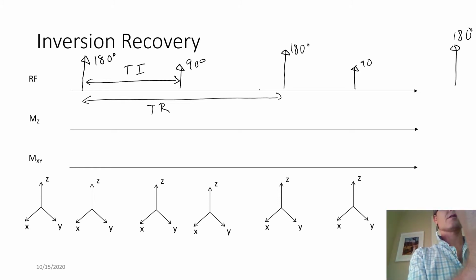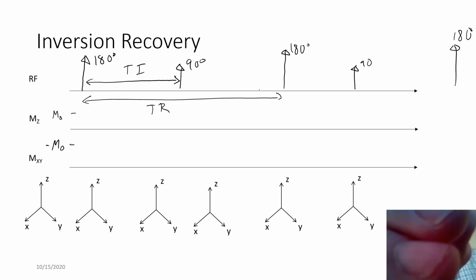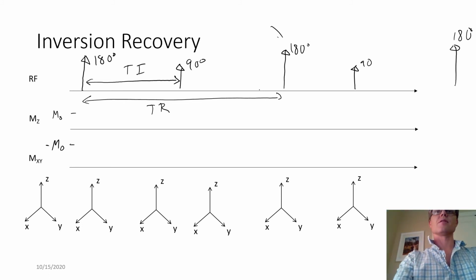And so what does the inversion recovery part of this name come from? It comes from really this 180-degree pulse, and these are sometimes called inversion pulses.